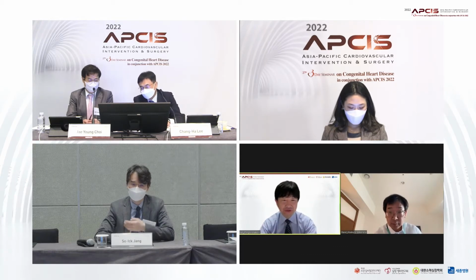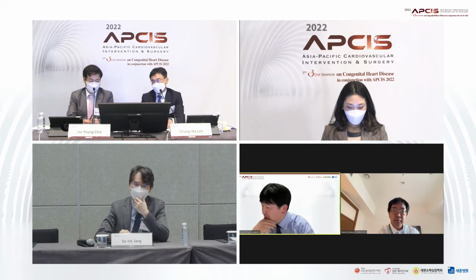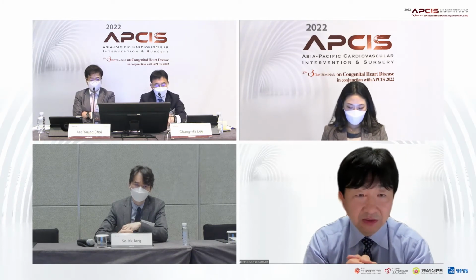Yes, I just asked that question at first, because of the risk of removing the whole stent. The stent was put in at 6 years old, and 5 years have already passed. I think in that situation the stent is probably inside the wall. And Dr. Jung also said that removing the whole stent is a problem because of intimal injury.